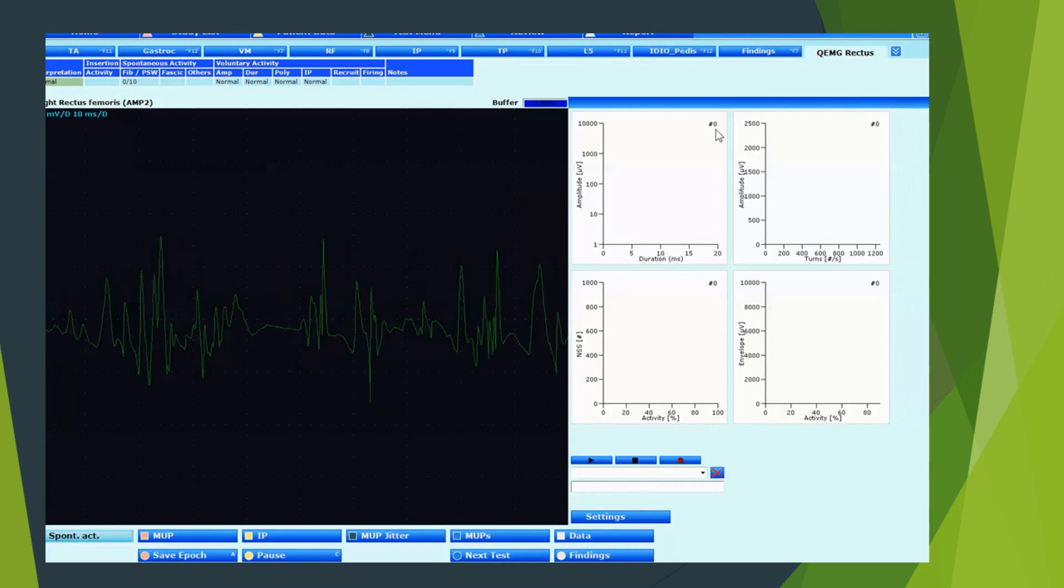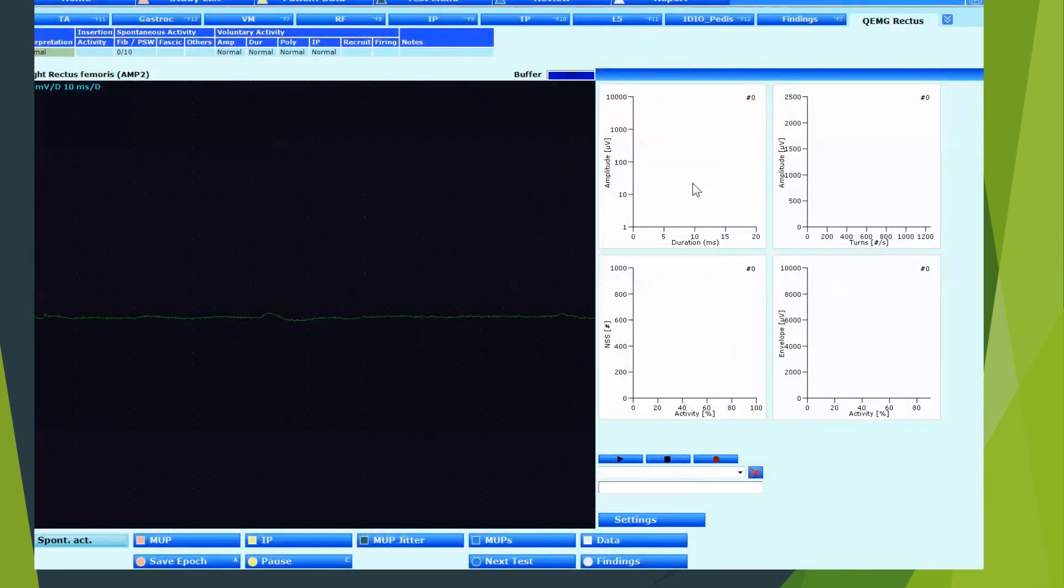The amplitude of these—I'm sorry you can't see the actual scale on here—but these are 0.2 to 0.3 millivolts in amplitude. The normal size is roughly between 1 and 2 millivolts, so it's quite significantly reduced in amplitude. You can see these are very spiky, polyphasic, and there are lots of these here on the screen. I'm now going to play a video of what happens in a myopathy. So here we go.